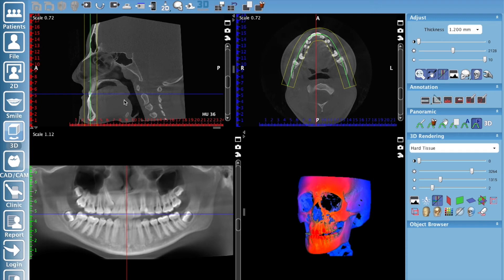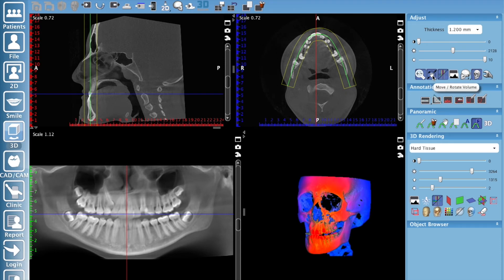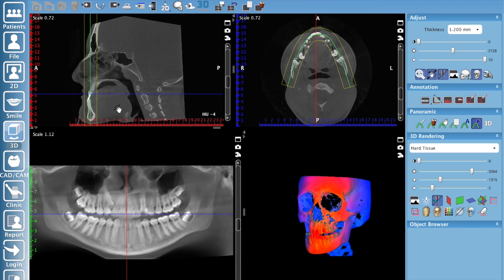That also helps clear up the anteriors, so that's a good thing to know. If for some reason you right click and it does not rotate, just make sure your move-rotate volume option has not been unselected. If that is unselected you don't have control with the right mouse click — so just make sure that's clicked and now you can make those fine-tune adjustments.